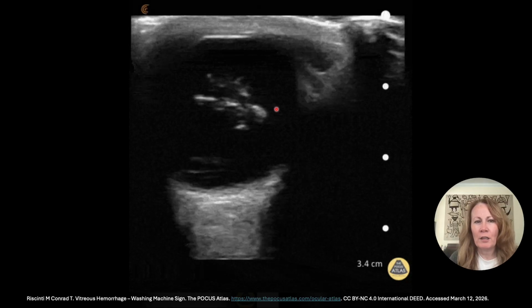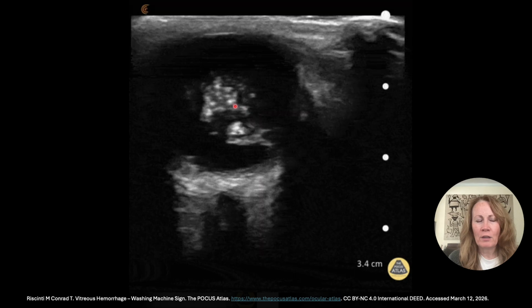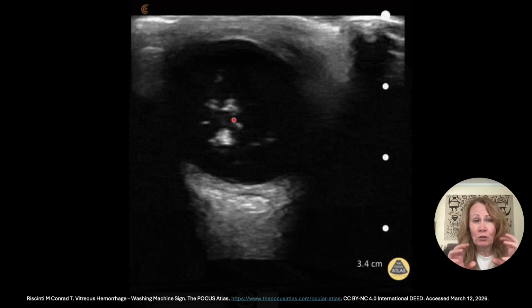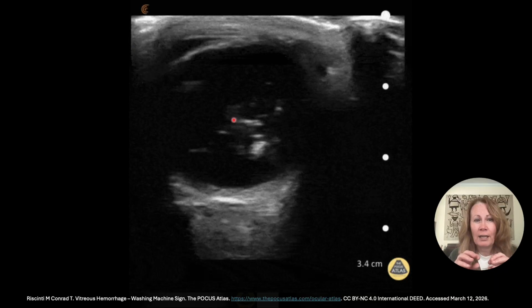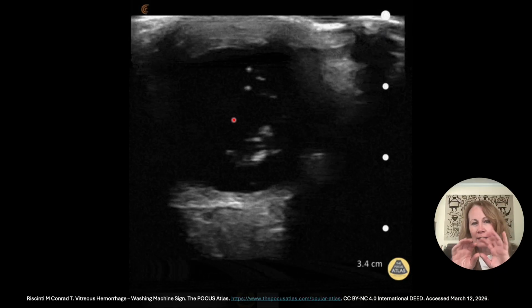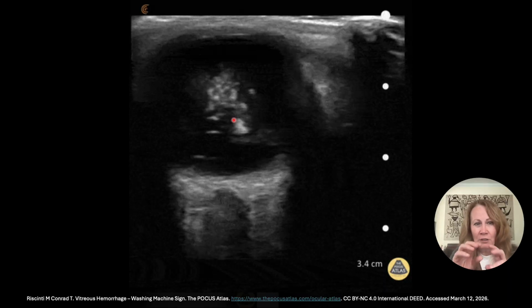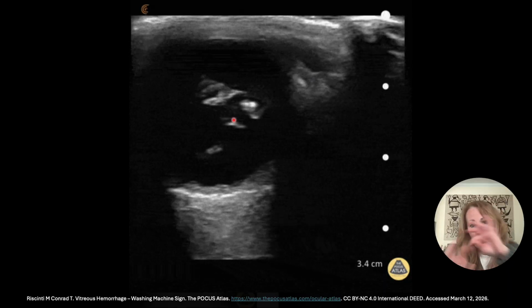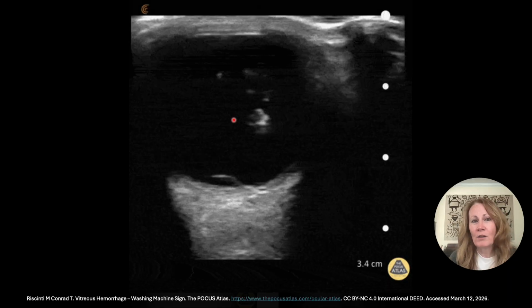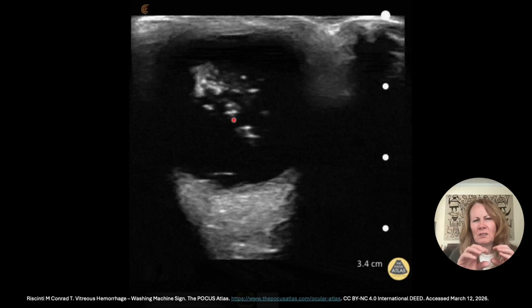And then moving on, comparing echogenicities against that anechoic presentation, we see these very hyperechoic structures more in the center of the eye, and some of them look like little dots, and as the person moves their eye back and forth, that echogenic material, very hyperechoic, swirls back and forth very freely. It's very mobile. Whereas in the other slide, the echogenic material was hypoechoic.